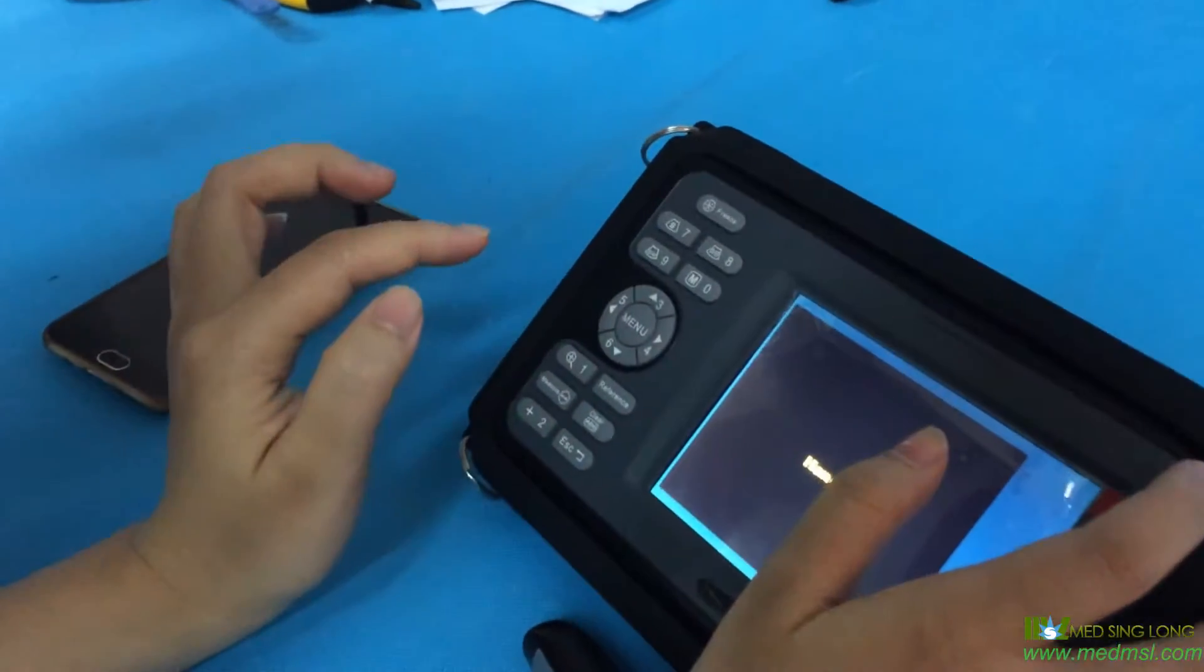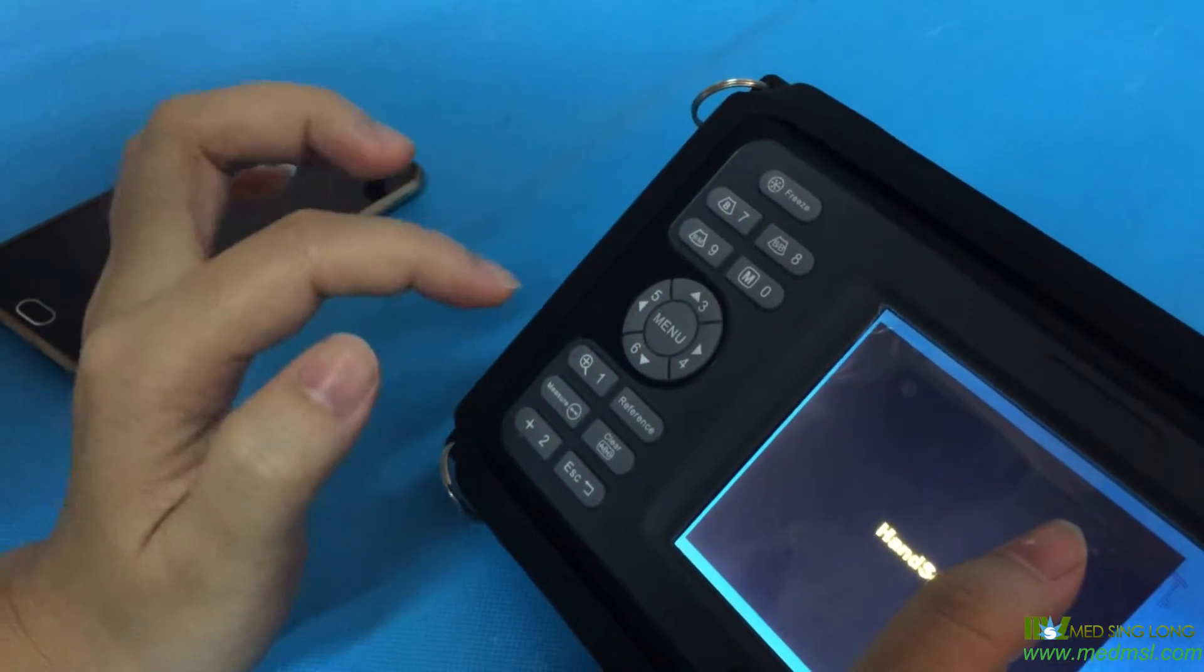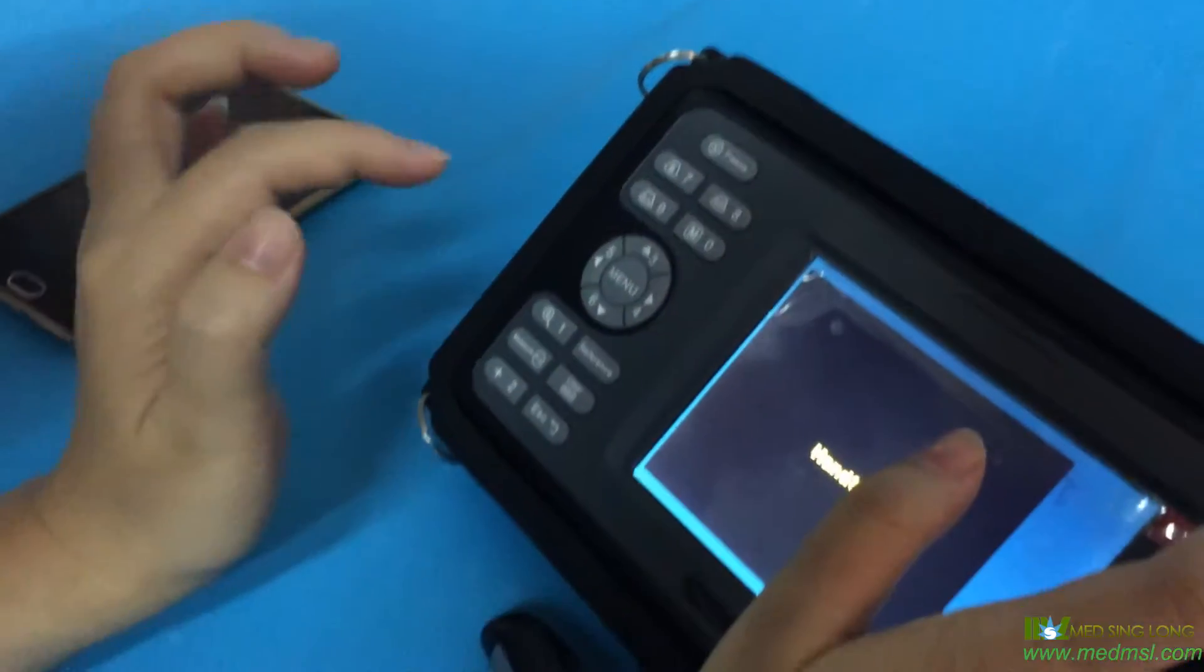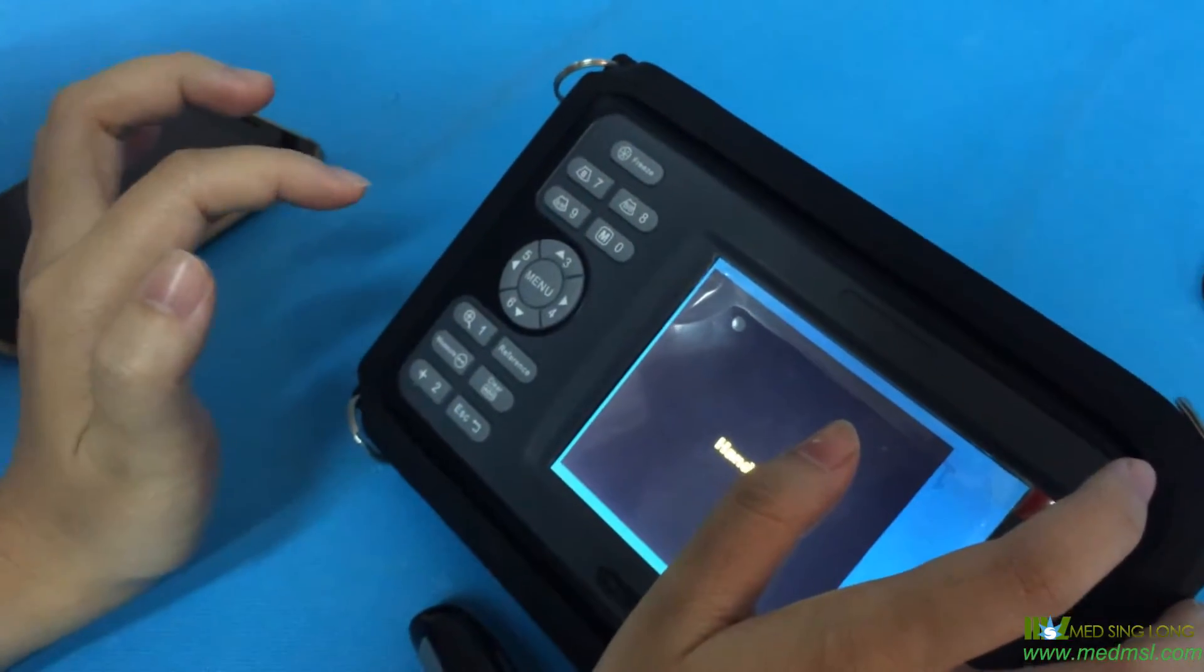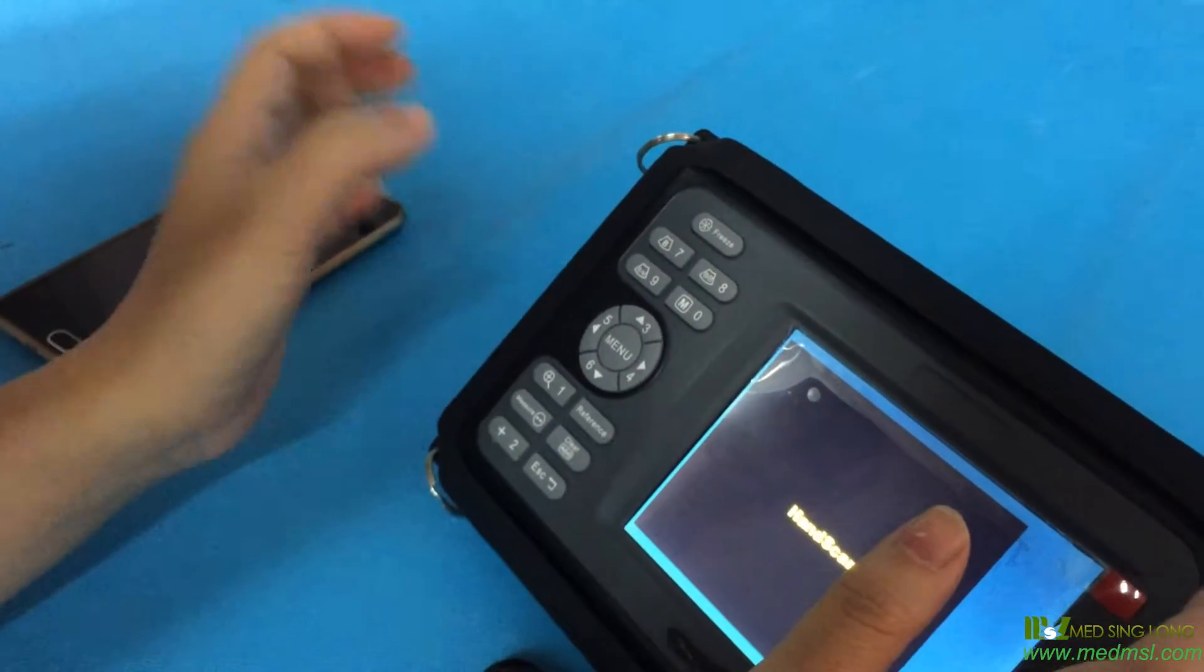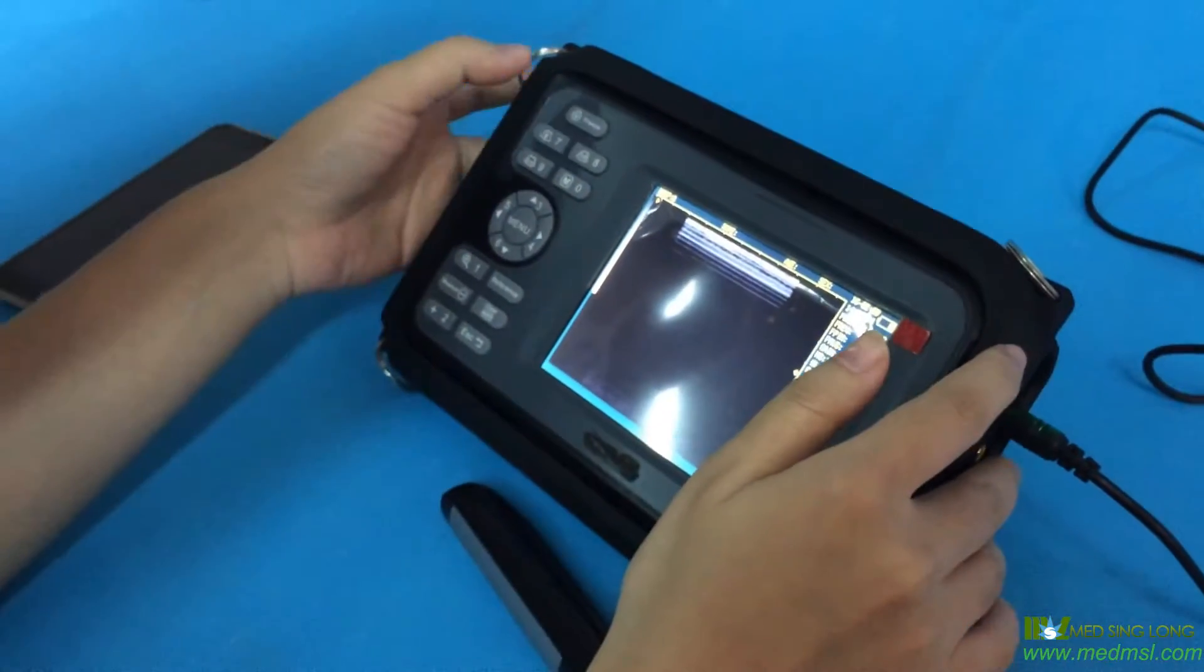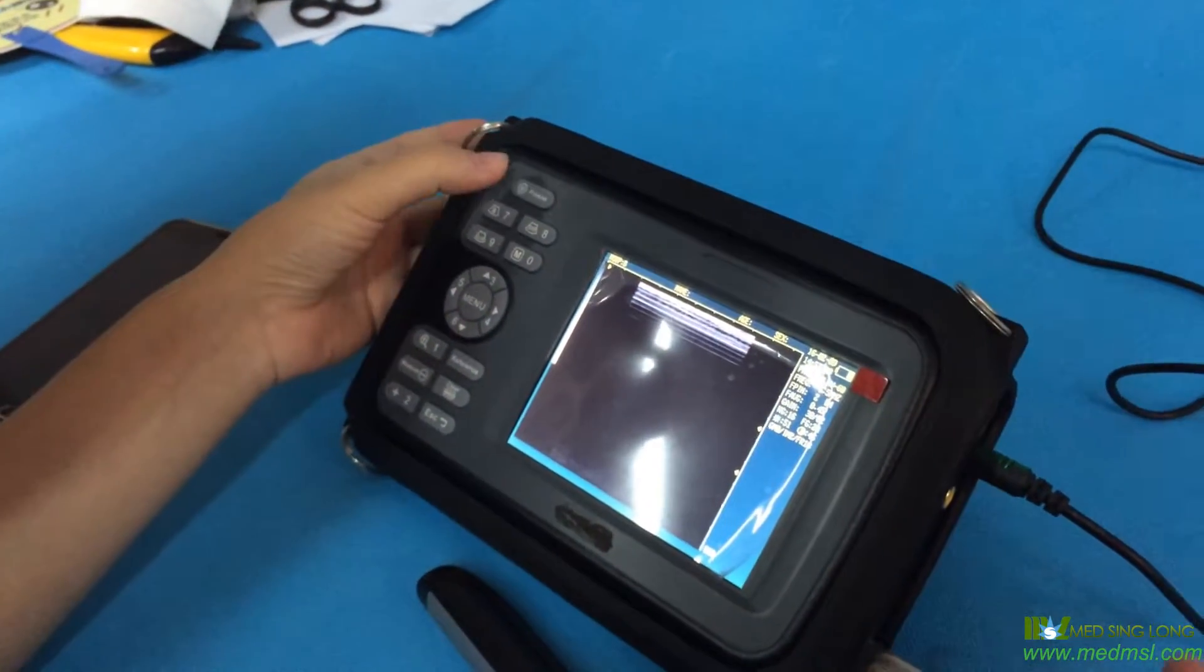This is our MSL VU-04 RET ultrasound scanner. Now I'm going to show you how to use our scanner. First, we must push the menu button and then we need to push the freeze button.